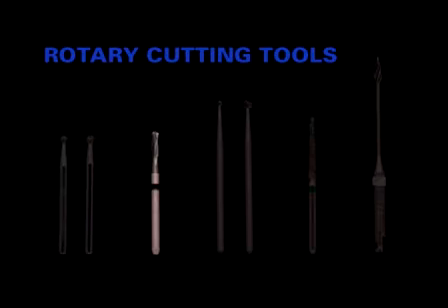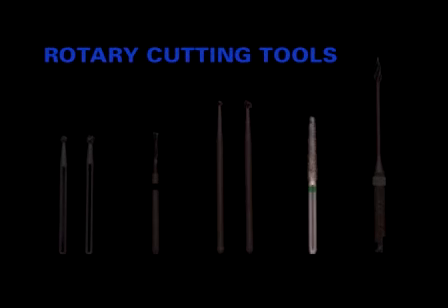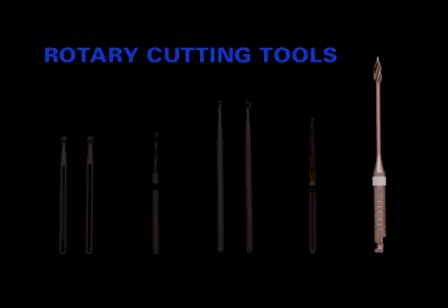When we're dealing with alloys or metallic restorations, a transmetal burr is useful to reduce unwanted vibration. Once we're into the dentin, surgical length number 2 and number 4 carbide round burrs are the instruments of choice as they serve to move the head of the handpiece further away from the occlusal table. A surgical length tapered diamond is used to finish the axial walls. Gates-Glidden burrs are essential to flare the orifices and give us a smooth transition from the axial walls into the orifices.